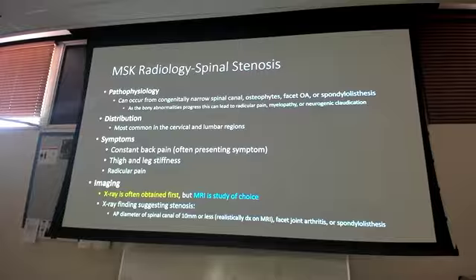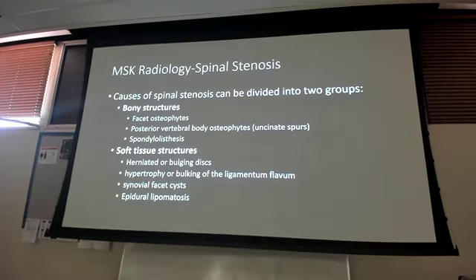I'll also be able to see if any of those intervertebral discs are herniated or bulging posteriorly into that spinal canal. I can see the spondylolisthesis and the osteophytes on x-ray, so sometimes I don't have to get the MRI if the x-ray gives me an answer for the condition, but if I'm not sure or it's not clear, then an MRI is my study of choice.